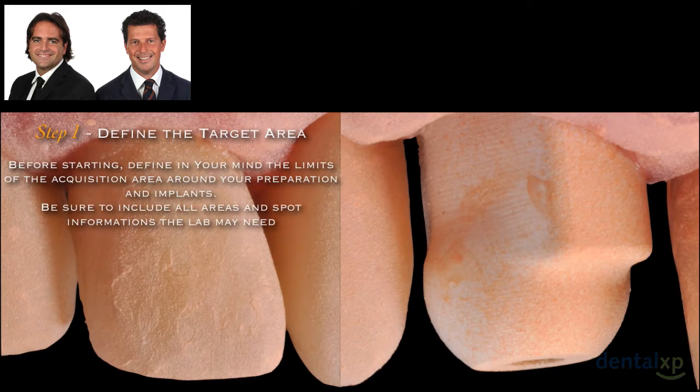The first one is where we define the target area, where we define the limits of the acquisition area around our preparation or our implant, and of course we want to make sure that we include all the areas and the spots and all the information that the lab may need.